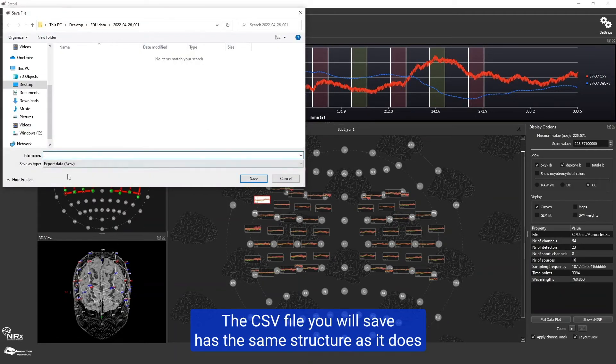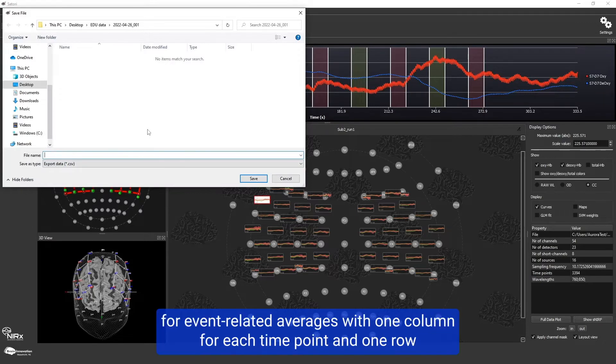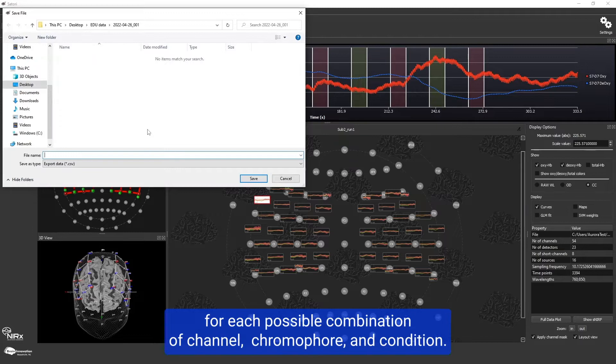The CSV file you will save has the same structure as for event-related averages, with one column for each time point and one row for each possible combination of channel, chromophore, and condition.